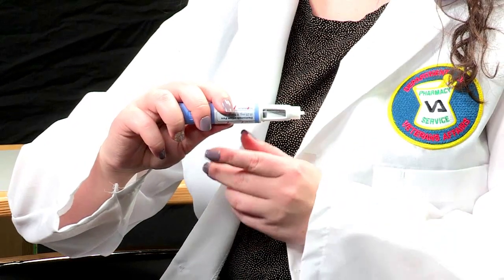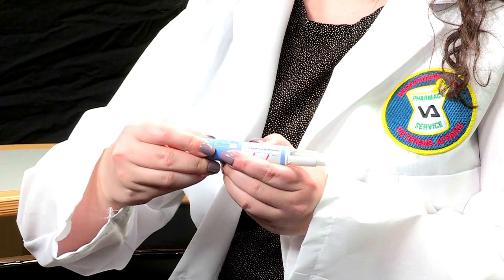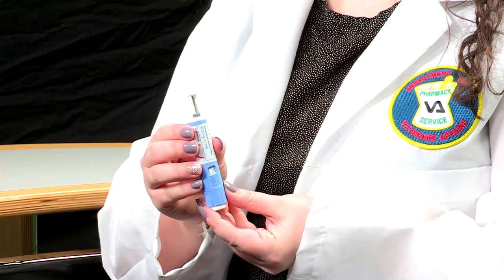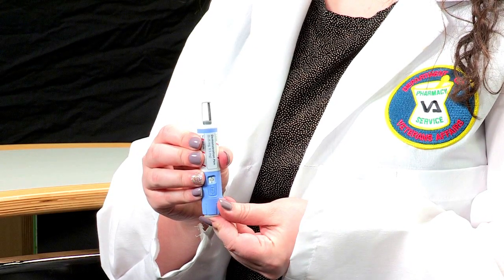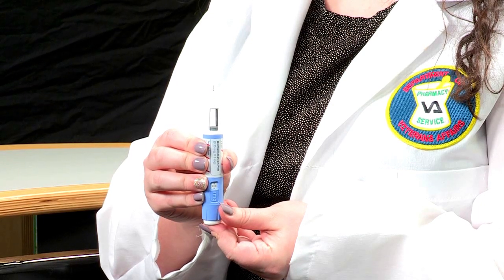The next step will be to check the flow before the first injection. You will need to complete this step with each new pen you use. Turn the dose selector slightly until the flow check symbol — dots or dashes — appears. Now hold the pen with the needle pointing straight up. Then press and hold the dose button until the dose counter moves slightly and shows zero. The zero should be lined up with the dose pointer. A drop of medication should appear at the needle tip, letting you know the pen is working correctly. If you do not see a drop appear at the end of the needle, you will need to repeat this step. You can repeat this step up to six times.